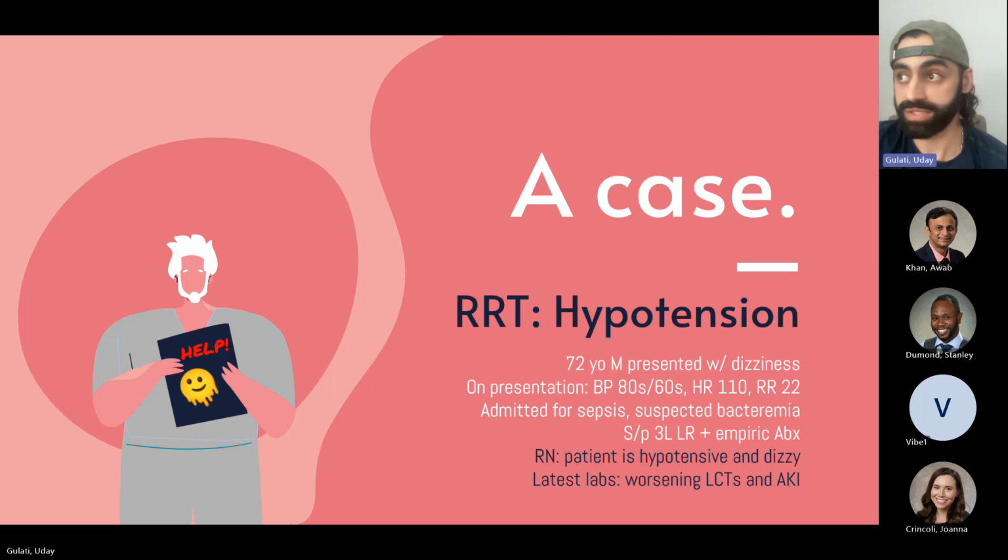So you mentioned using an ultrasound device. What are you trying to assess when you put the probe on the patient, besides ensuring that you get IV access? Yeah, determine potential causes for the low blood pressure. So if he's having minimal contractility in his heart, is it cardiogenic shock? Is he having RV collapse suggestive of a PE? You could look for venous congestion in the liver. There's a lot of different things you can use it to help determine the etiology of the hypotension.